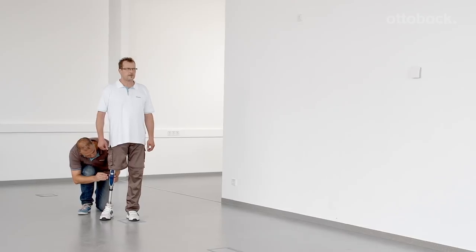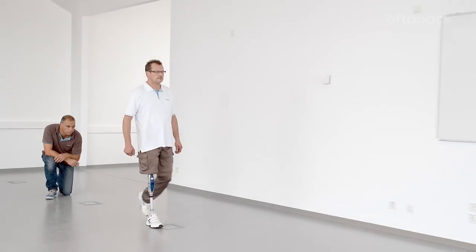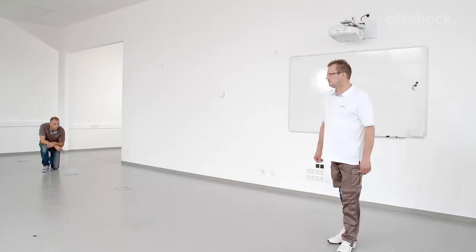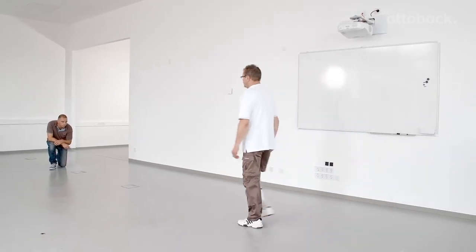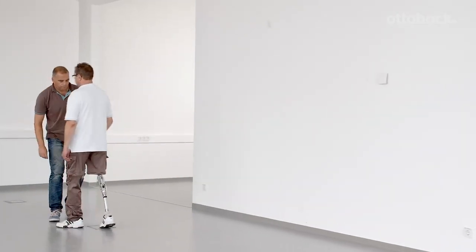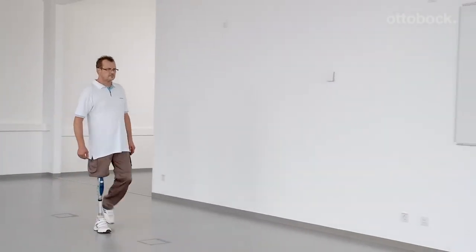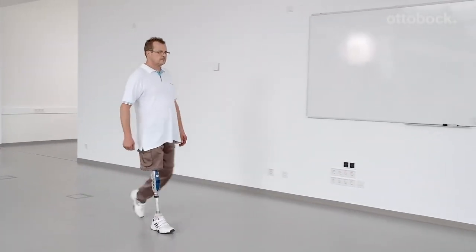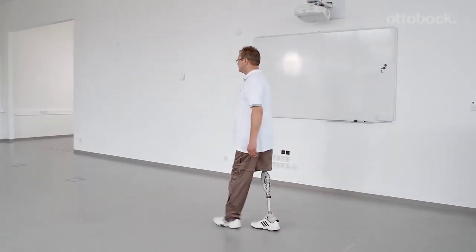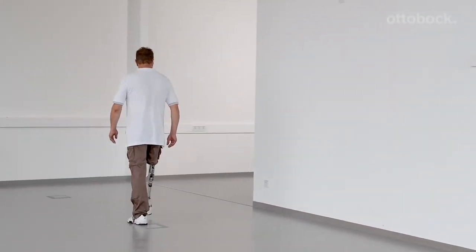The polycentric multi-axial joint design reduces the total length of the prosthesis during swing phase up to 25 millimeters, depending on the flexion angle. Thus, the user obtains a higher ground clearance in the middle of the swing phase, and the risk of tripping is reduced. The progressive damping of the 3R60 prevents a hard extension stop, resulting in increased natural movements and comfortable end position damping for a large range of walking speeds. Now the knee is set optimally for the end user, and further walking exercises can be completed.